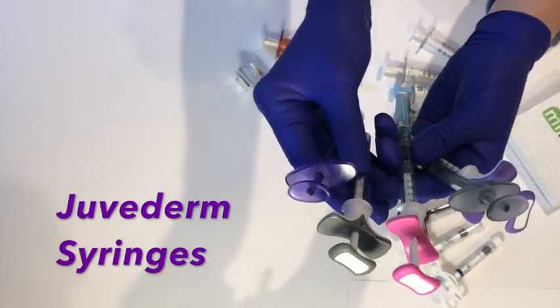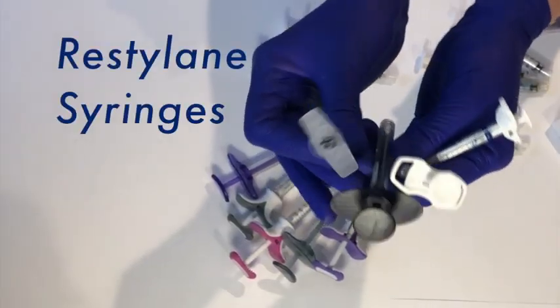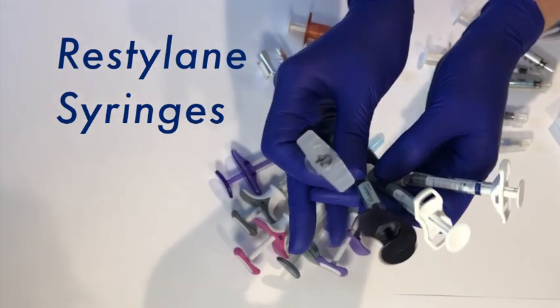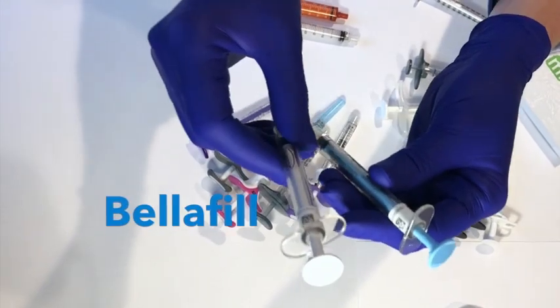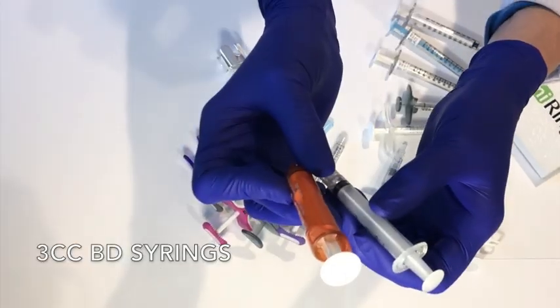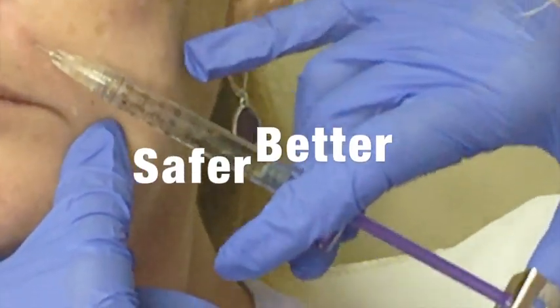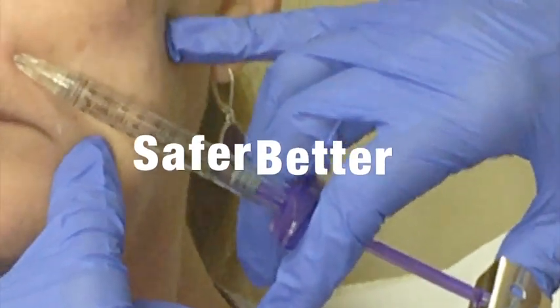Myring can be used with Juvederm syringes, both old and new, Restylane syringes, Mertz, Radius, Belotero, Versa, Belafil, and even 3cc BD syringes. Become a safer and better injector with Myring.